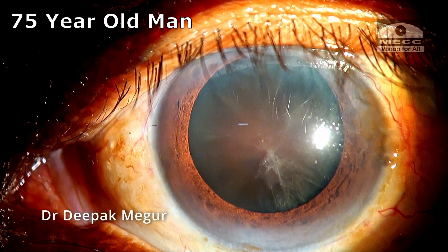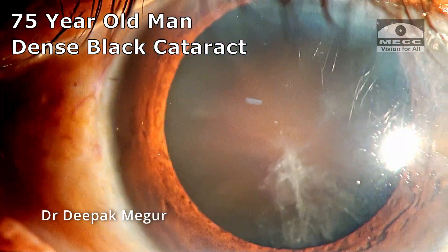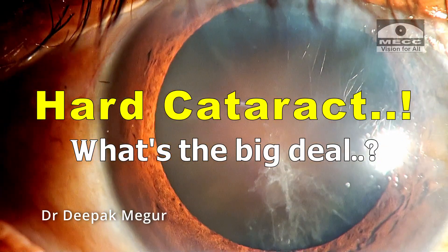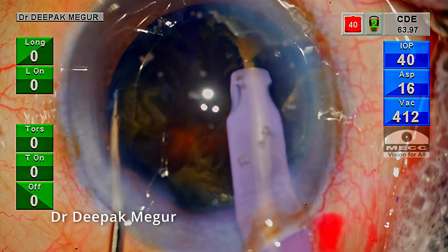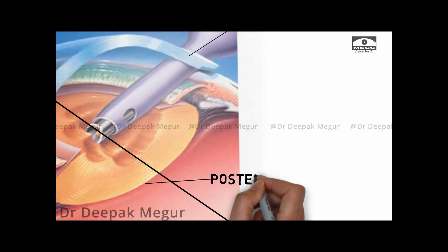Hello friends. This is a 75-year-old patient who has a very dense black cataract and is scheduled for phacoemulsification. Let's understand what is the big deal about managing these dense black cataracts. There are multiple challenges. To begin with, the visibility will not be great. Dividing the nucleus is quite difficult, and while dividing the nucleus we can have intraoperative complications, especially related to the capsule-zonular apparatus.